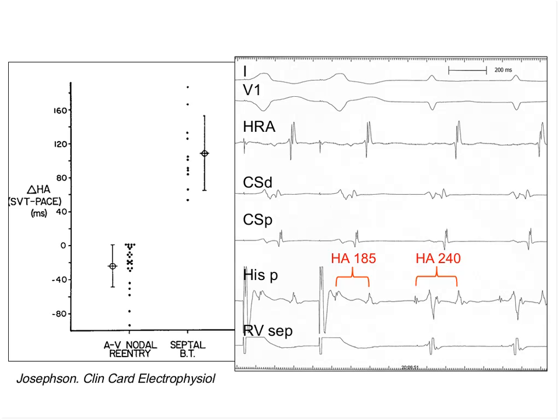And in these cases, the sequence of activations probably is not all. We need stimulation. So this is just to stress that point, because in this case, we can see how the activation is coming through the distal coronary sinus. But in all those cases that you stressed before, these maneuvers are really, really useful.